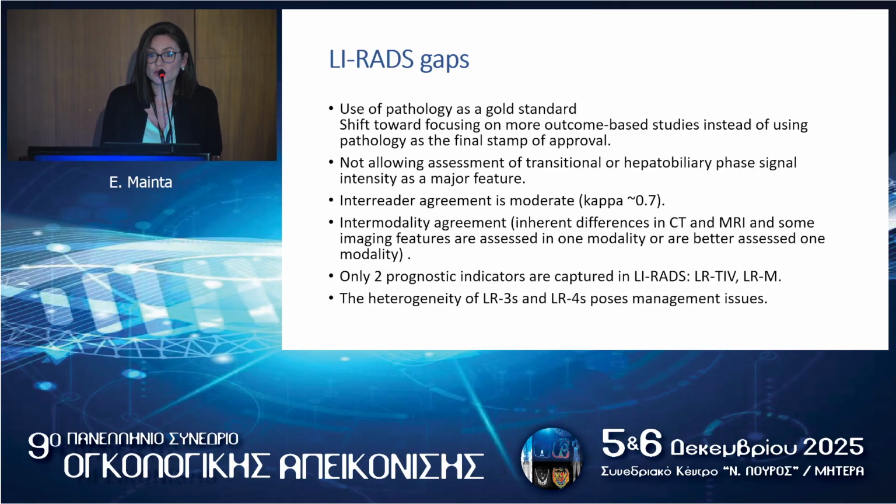There remains moderate inter-reader agreement, and there is the challenge of intermodality agreement. LI-RADS only use 2 prognostic indicators, the TIV and LR-M category, and there remains the challenge of the heterogeneity of LR-3 and 4 lesions with very difficult management issues.